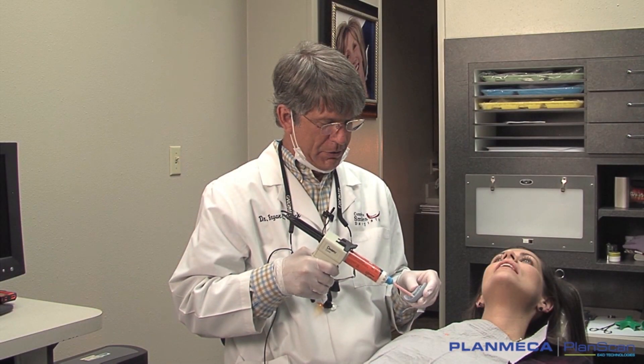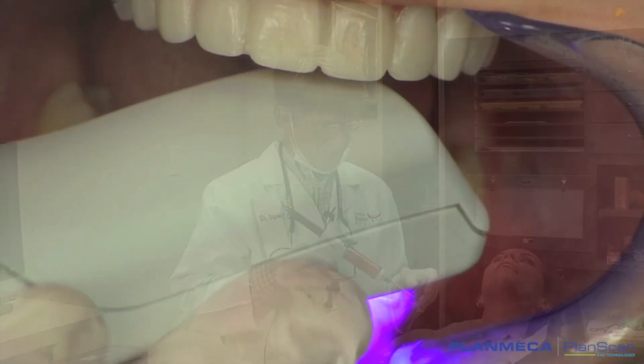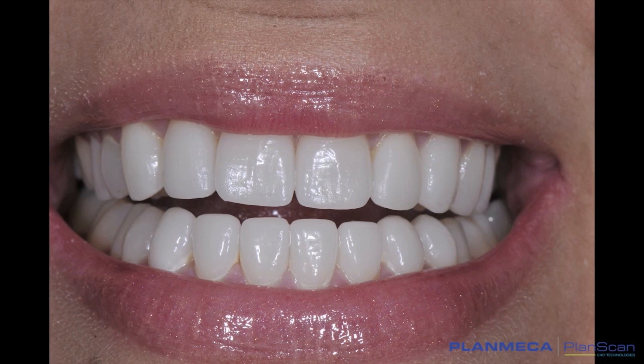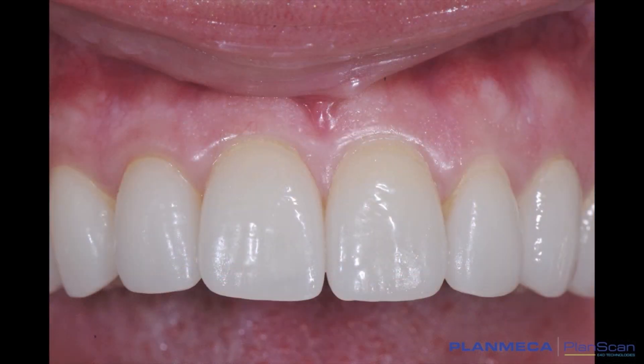Can I take my occlusion philosophy and marry it with CAD-CAM? Yes, I actually can. When talking to my patients, I can offer them the best. What used to be two appointments, maybe two weeks in between, possibly multiple injections and impressions in their mouth — I can eliminate that to one injection. I can also remove the need for impression material by digitally scanning, and I can manufacture a restoration and give it to them same-day. Once you've done that, your patients will not want to experience a crown any other way than same-day restoration.